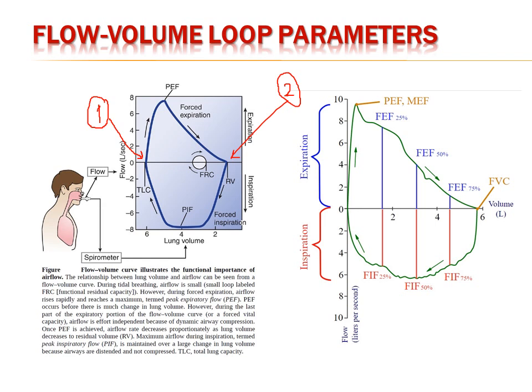The reason for that is very simple, and I explained that for you in the lectures. When we do a forceful expiration, the lung will compress the bronchioles and the resistance will increase. So the more force we use for the expiration, the greater will be the resistance for the outflow of air from the lung.